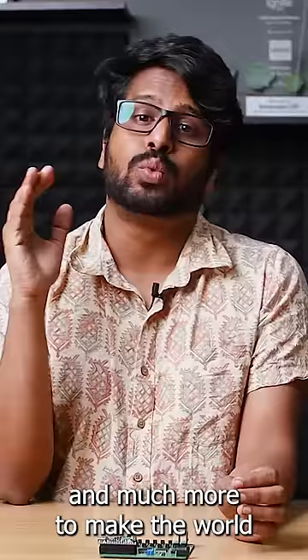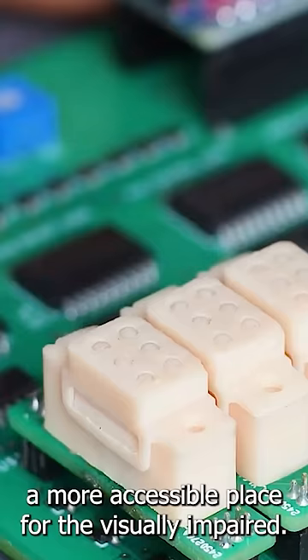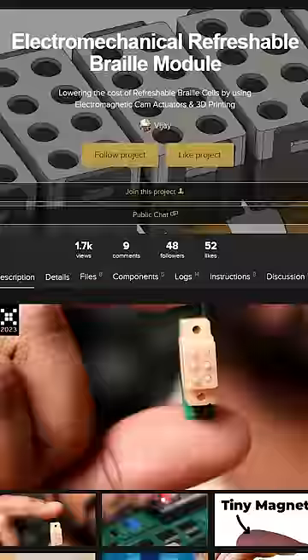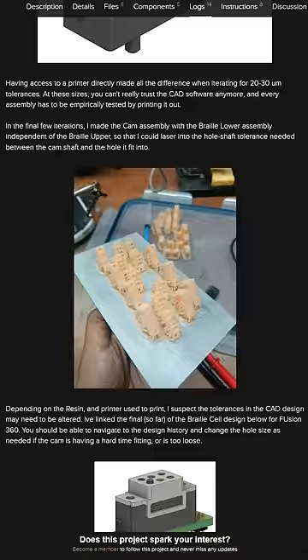I'm really excited because I saw a Hackaday Prize submission today by Vijay Verrata. He has an electromechanical refreshable Braille module — that's one of these little Braille cells. These things can be really expensive, upwards of $100 sometimes, and he's got the material cost using 3D printing down to a little over a dollar.